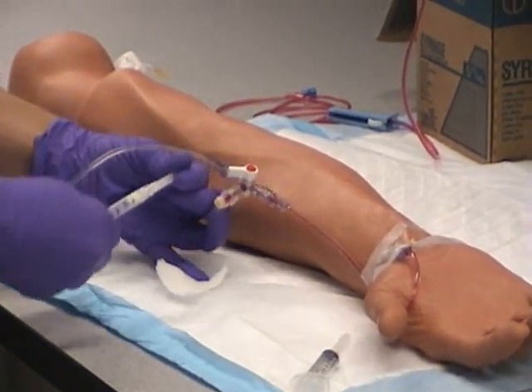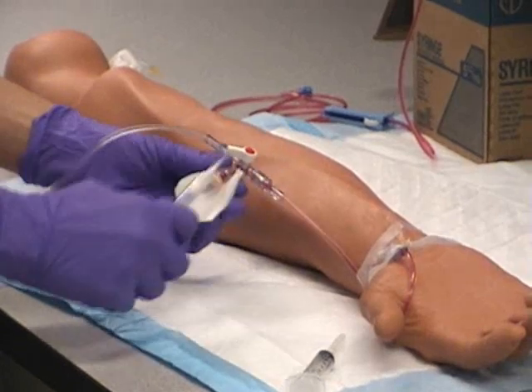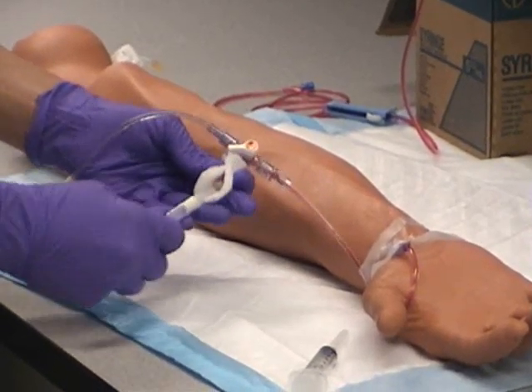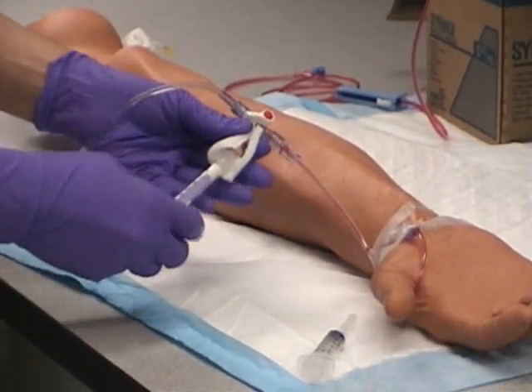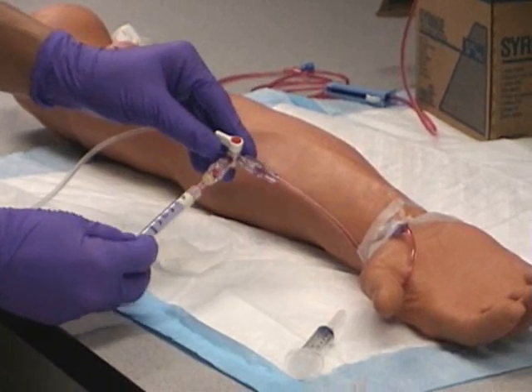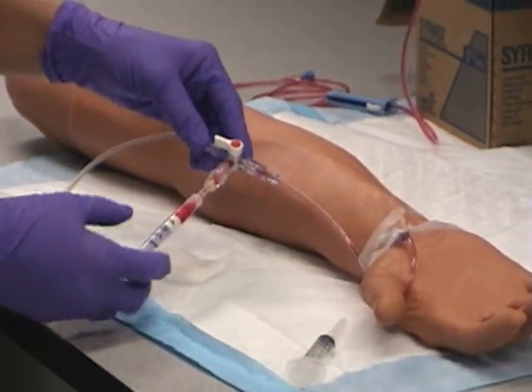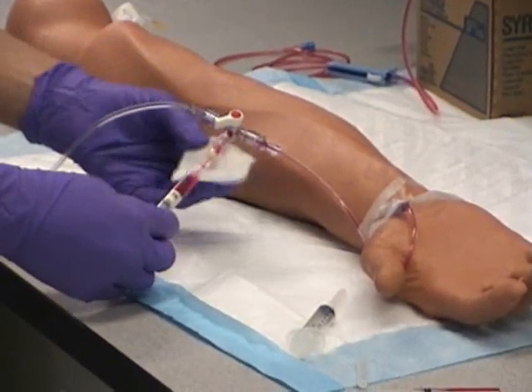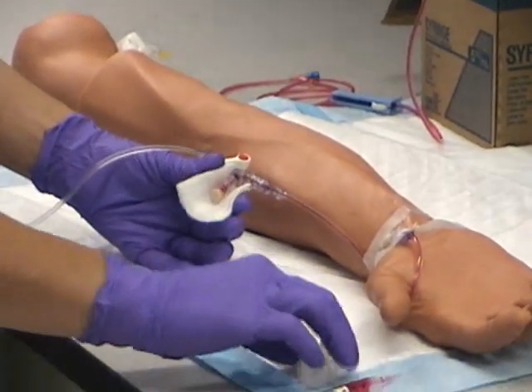Now use your arterial blood gas syringe and poke it into the rubber port. It will sometimes bounce back at you — just find the right spot. Turn your port off to the system and withdraw your pure arterial blood gas sample. About 1 mil will do. Turn it off to everything and pull that off. Set it aside for later.